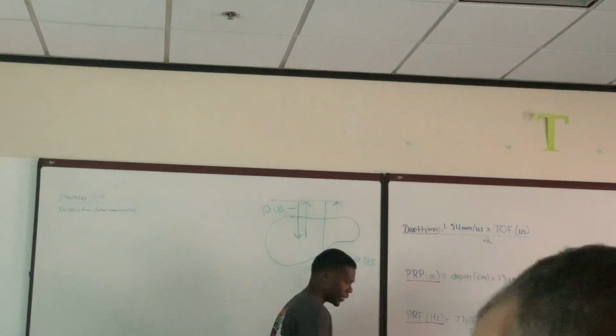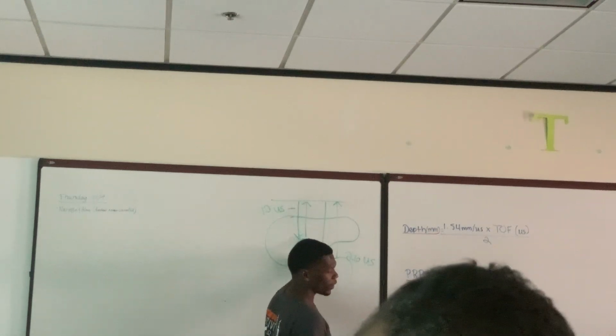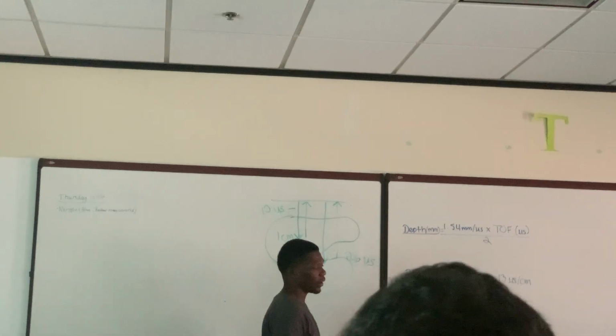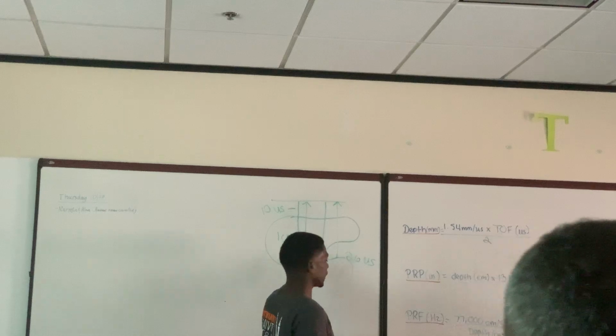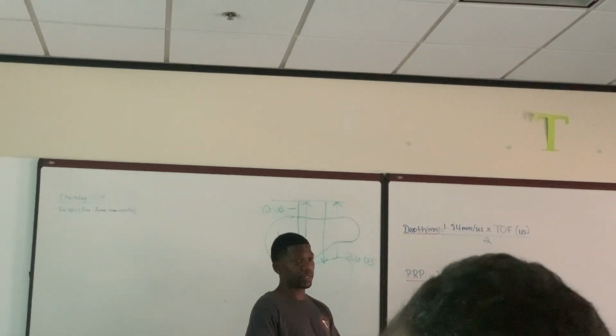And this is going to continue. So basically what I'm saying is that this point in that liver is only 1 centimeter deep. Okay? This is equivalent to 1 centimeter, because that's about sound traveling at 1.54 millimeters per microsecond. Every 13 microseconds, sound is traveling 1 centimeter. That's what I want you guys to know. That's the most important thing about this chapter.